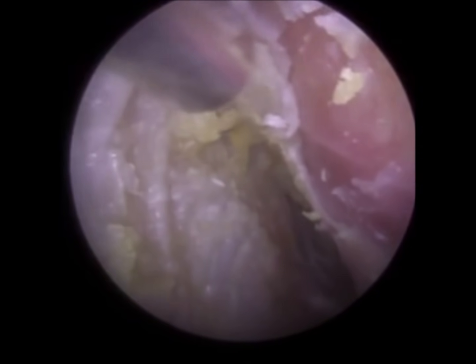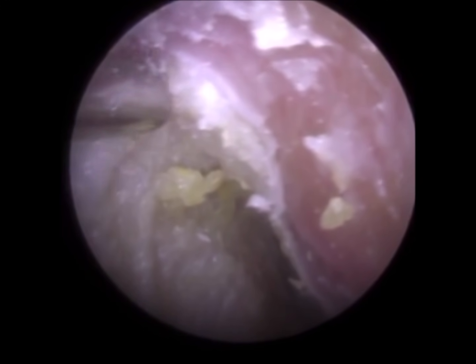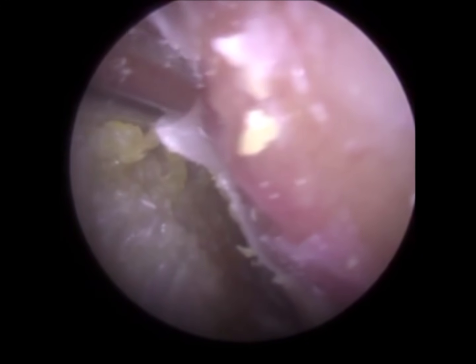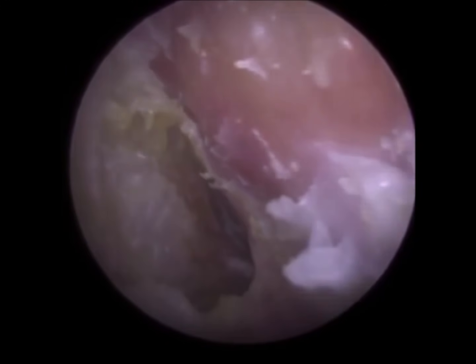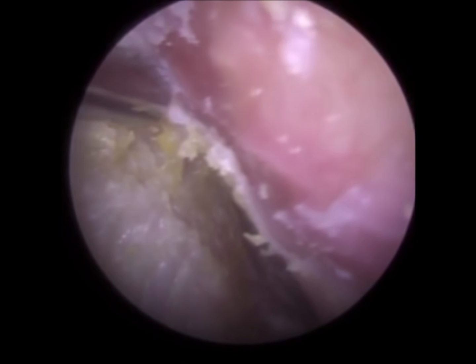So I'm having to go in and out quite a lot because we're using a fine end gauge. You can get blocked very easily with this mushy type of dead skin keratin. Just approaching the eardrum, so again we can be very careful. And we want to avoid contact with that bony part of the ear canal. You can see the ear canal there, it's very sensitive. You need a steady hand to avoid contact. So again, right near the eardrum. In fact, we're just on the eardrum there. I just want to see if I can peel this down off the eardrum.